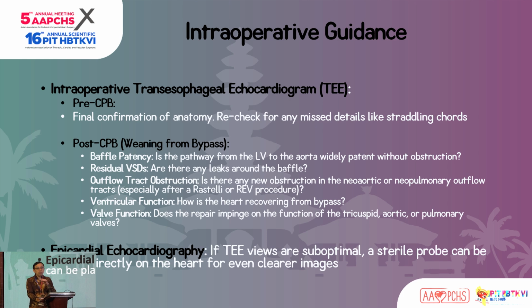So intra-op, how to optimize it. Intra-op, we mainly depend on TEE. Pre-bypass, it confirms the anatomy of the DORV. So a recheck for any missed details, especially for straddling valve. This may actually make us change the surgical plan.